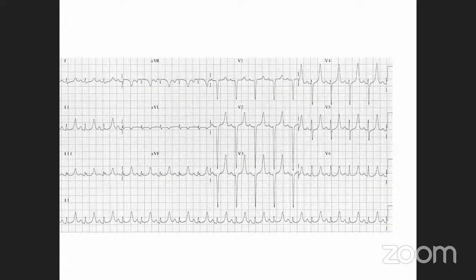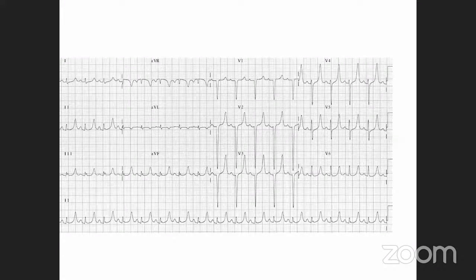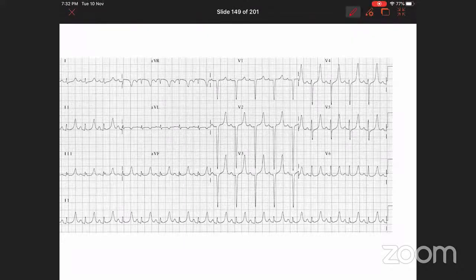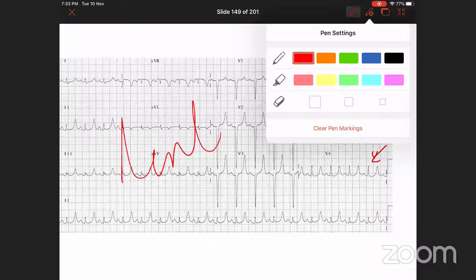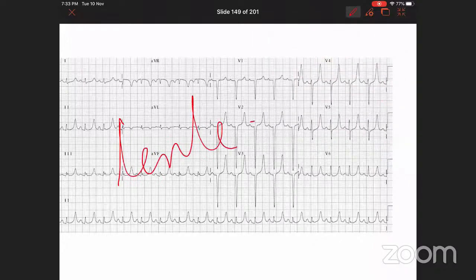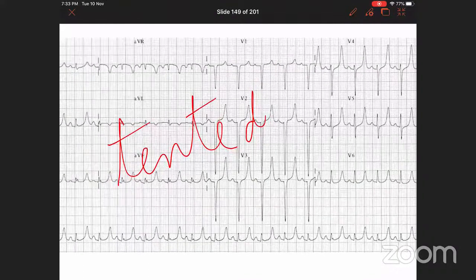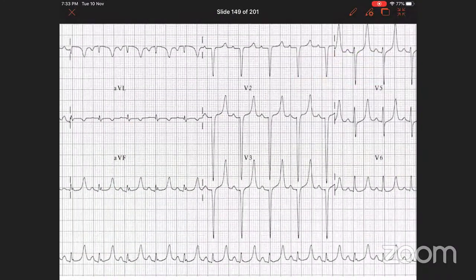This ECG shows very tall, tented T waves — classic tall and tented T waves of hyperkalemia. When evaluating T waves, always compare their height with the QRS complex, especially in the lateral precordial leads. Here the T waves in V5 and V6 are as tall as or taller than the R wave — this is the classical tall tented T wave pattern of hyperkalemia.